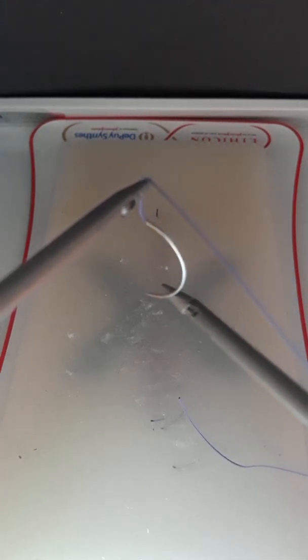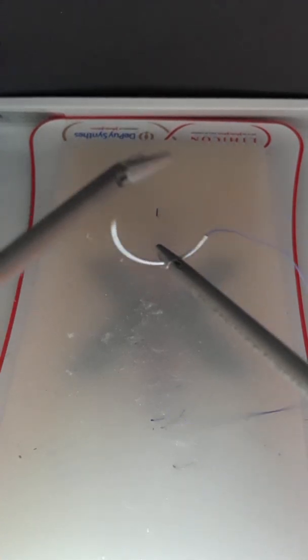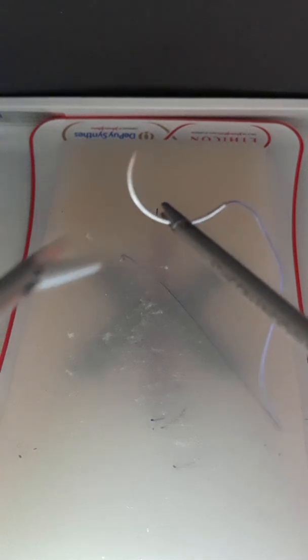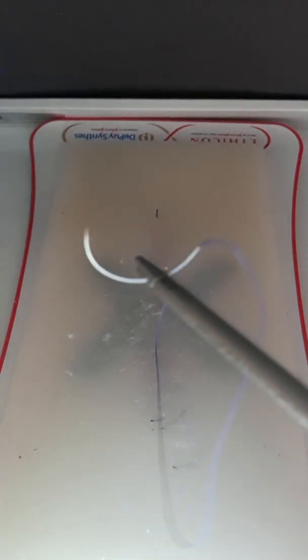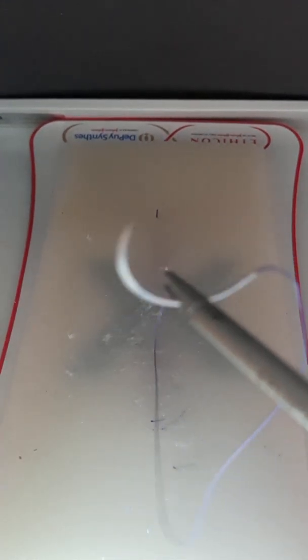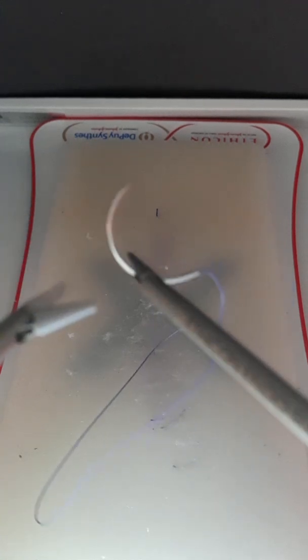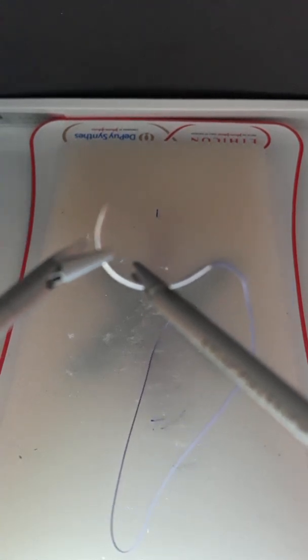Here are a few things: you want to grab the needle about one centimeter away from the heel, and try to avoid grabbing the distal third of the needle. Right here I'm going to grab it from three-fourths of the way, and with my left hand do a little adjustment to overcome that 2D-3D challenge in laparoscopy.